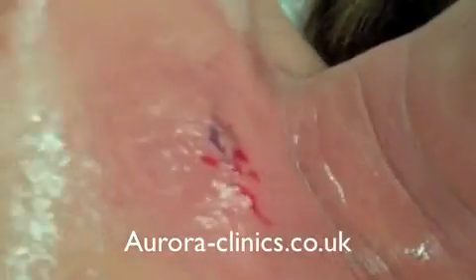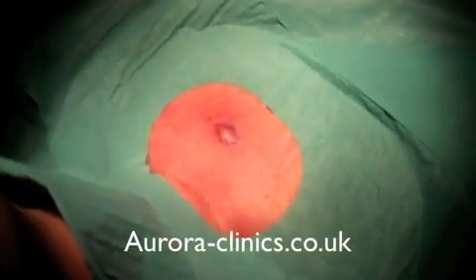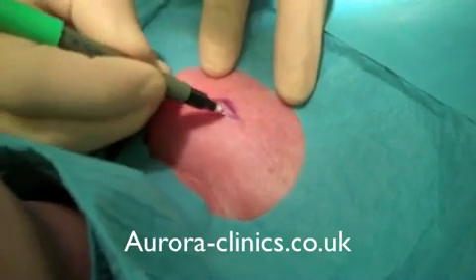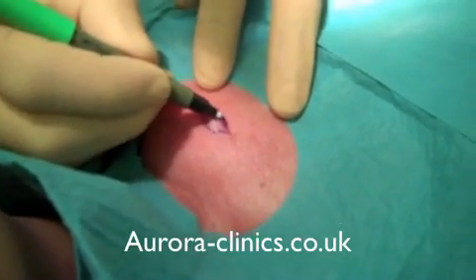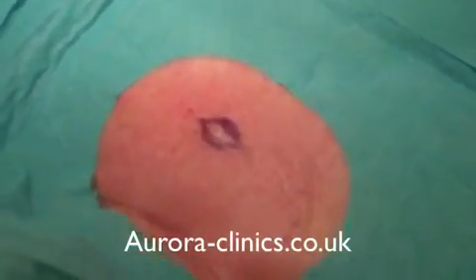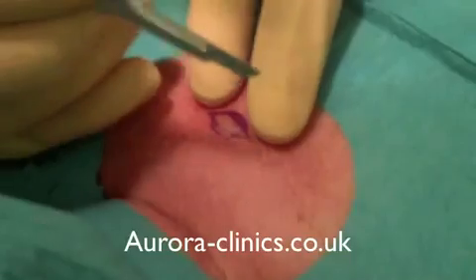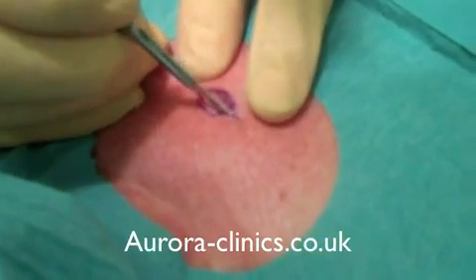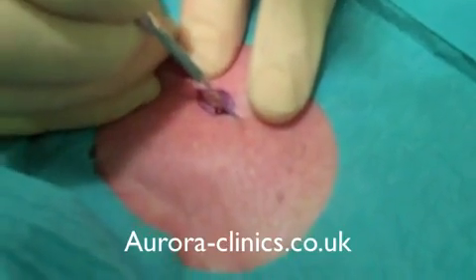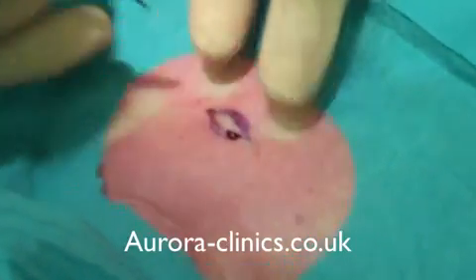Here you can see this lady's got a sebaceous cyst on her anterior neck area. I'm cleaning it with aqueous chlorhexidine, and I've already done some markings and put my local anaesthetic in. Here I am just marking again, using a fine nibbed pen, marking just where I'm going to make my incision. It's very important to look out for a punctum, which is basically an open pore, and include that in your ellipse. That might be slightly off centre, but do include it because that's the opening for the cyst.